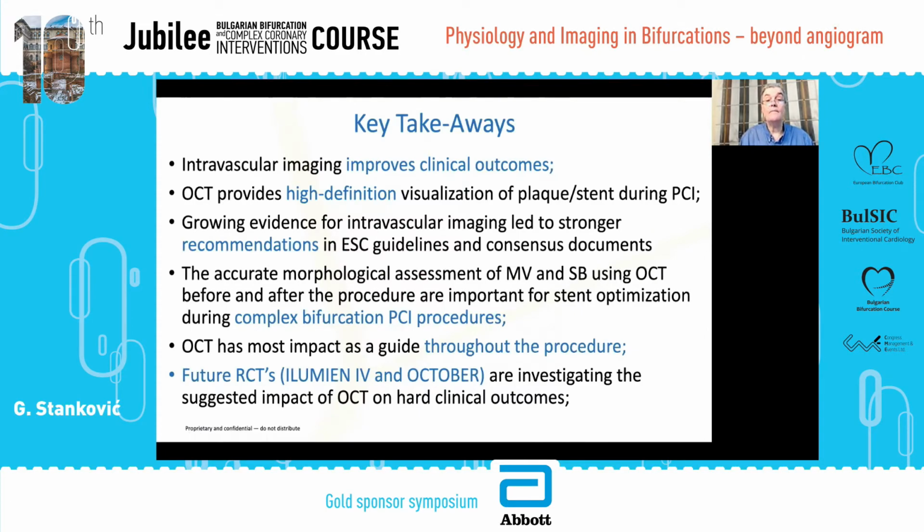So dear colleagues, my key messages are that intravascular imaging improves clinical outcome. OCT provides high definition visualization of plaque and stent during PCI. There is growing evidence that imaging should lead to stronger recommendation in the guidelines and consensus documents.